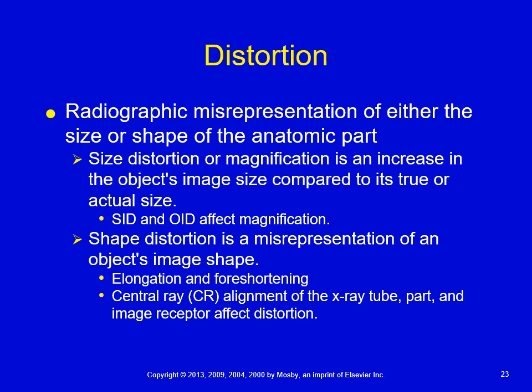Now, the reason why we use a 72-inch SID, that's a standard protocol, but if you went back and changed the SID, what I want you to look at, which you did already, is what happened to the heart when you brought the tube closer. Also, with left lateral, the heart is typically shifted to the left side. So the reason why we do the left lateral is so that we can get the heart as close to the chest bucky as we can to reduce the distance.